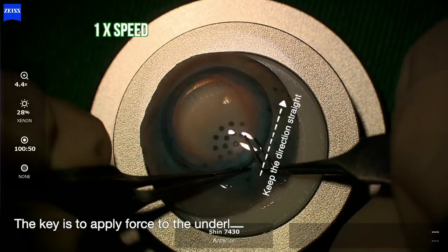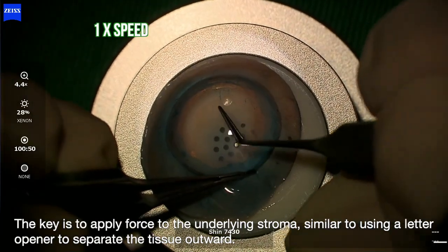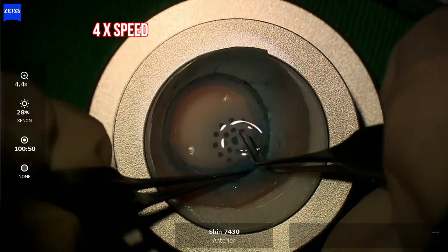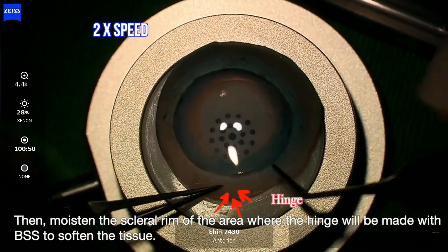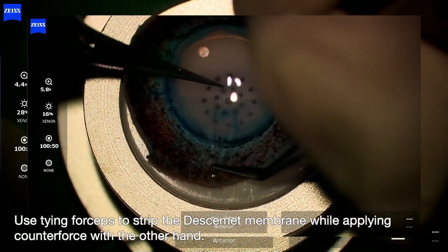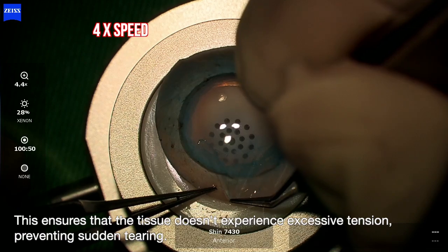The key is to apply force to the underlying stroma, similar to using a letter opener to separate the tissue outward. During this process, check for any torn edges. If they are present, remove them first. Then moisten the scleral rim of the area where the hinge will be made with BSS to soften the tissue. Use tying forceps to strip the Descemet membrane while applying counterforce with the other hand. This ensures that the tissue doesn't experience excessive tension, preventing sudden tearing.